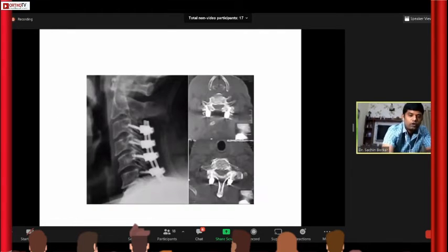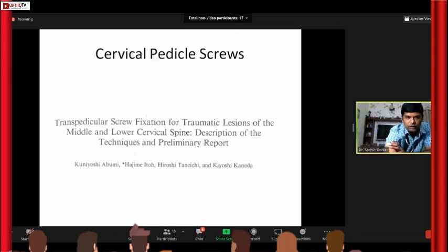So in case of problem, actually, though it is not in the purview of this course, just a brief 2-3 slides about cervical pedicle screws. If there is a cervical lateral mass breakage, you can skip one level and go to the other level. That is the best way. In case it's a deformity, and you require big biomechanical anchors, meaning the strength should be better, then pedicle screws are also utilized.